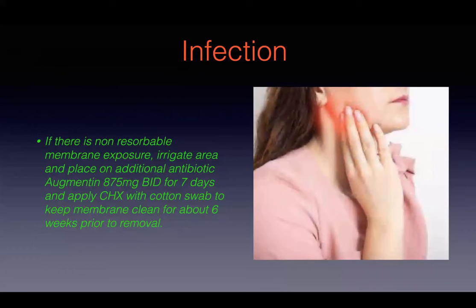Causes of membrane failure. One is compression of the prosthesis, or maybe not releasing enough of the flap. In the beginning, it's easy to be kind of shy and not really flap as much. And that works against you. You want to flap as much as possible, so that you have a tension-free closure. GBR factors for success: you want a good flap design, adequate blood supply, access to bone-forming cells, tension-free closure, adequate suturing, the size of membrane perforation, and barrier occlusion and stability.